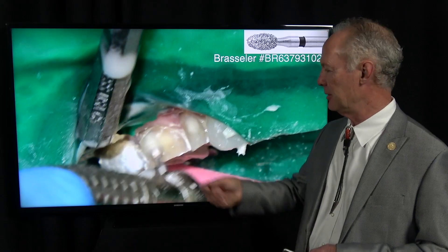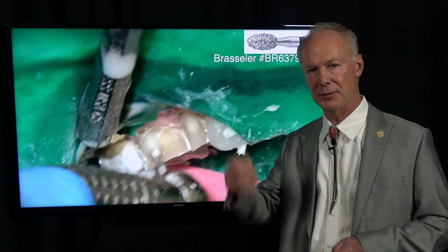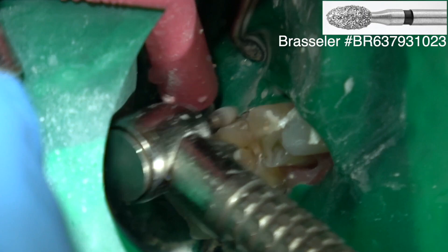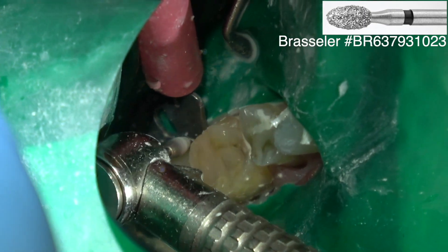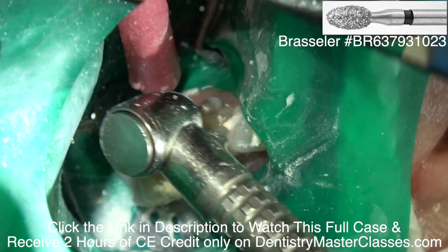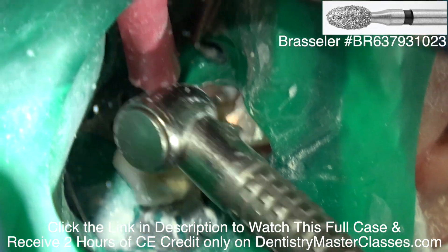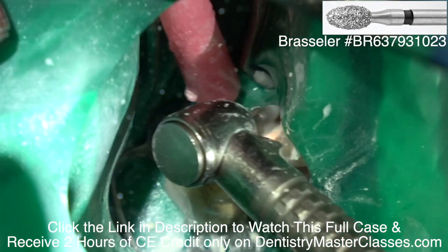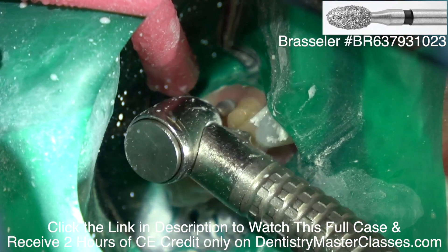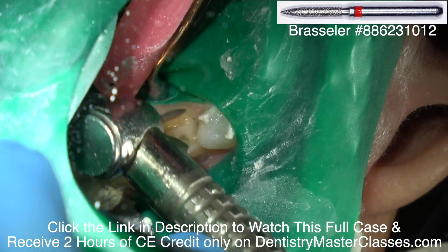Especially if they had hypersensitivity prior to tooth preparation and the hypersensitivity got worse after crown placement — so I test them. You can watch my videos on how to test teeth with ice to see if they're hypersensitive. Usually the patient will tell you that they have trouble drinking or eating anything that's real cold, and if they do, endodontics on those teeth may be part of the treatment plan.